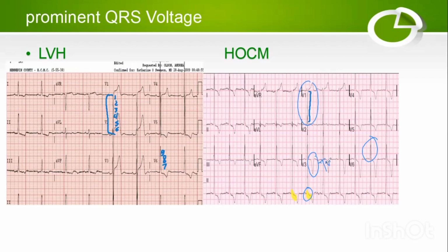What about the total criteria: T wave inversion, ST depression, and S in V1 plus R in V6 more than 7 large squares, by vertical count. Understand? Okay, diagnostic for HOCM.